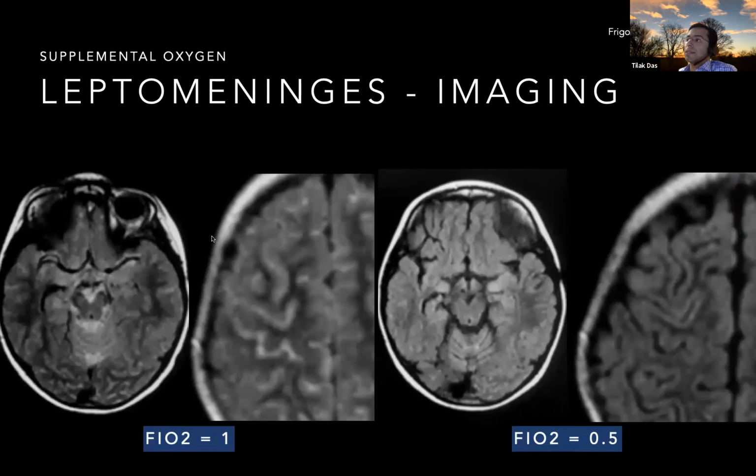Just some caveats, one of which is oxygenation. So if you have a patient who's intubated for their scan, for example, especially in the pediatric population, that oxygenation may lead to an artifactual T2 hyperintensity, FLAIR hyperintensity. But it would tend to be, of course, much more symmetrical and uniform, but don't mistake that for a florid meningitis, for example.